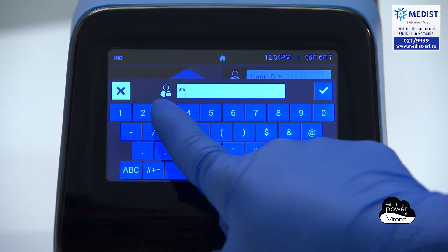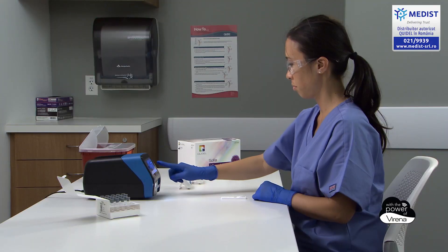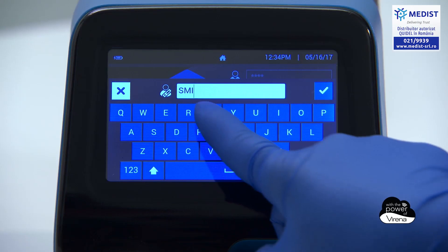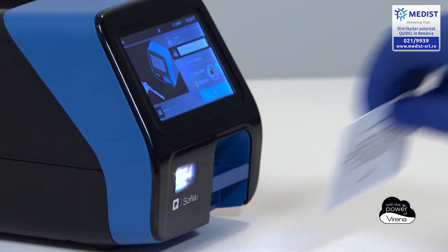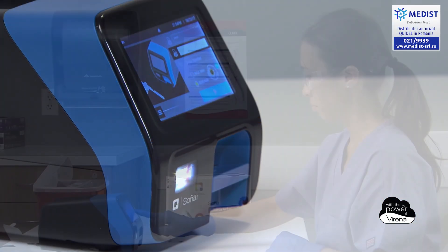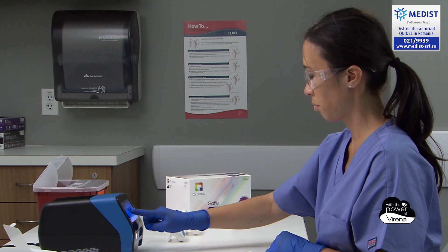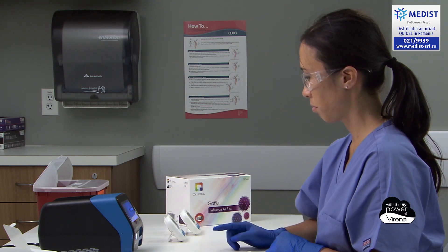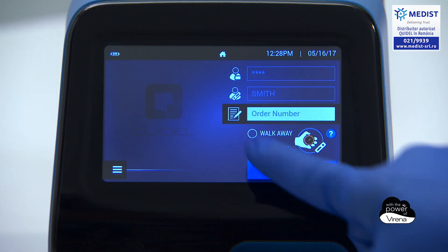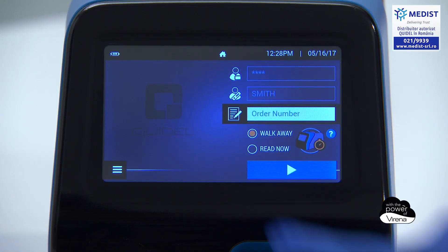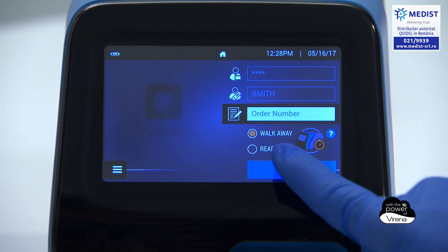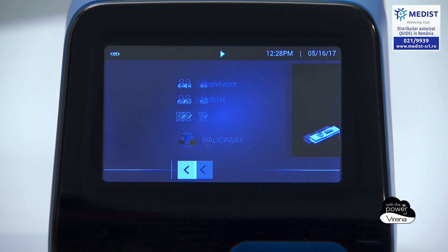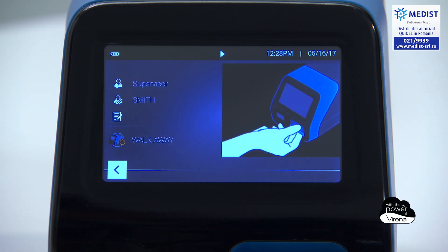Enter the user ID and patient ID by using the touch screen or integrated barcode scanner. Ensure that Sophia2 is set to the desired mode — read now, or in the case of this demonstration, walk away mode — and press the start test button and the forward arrow.